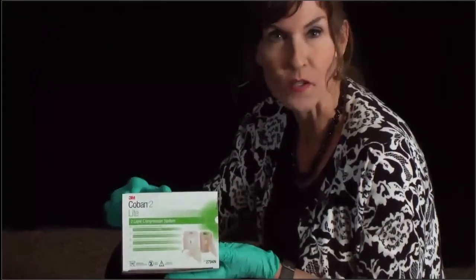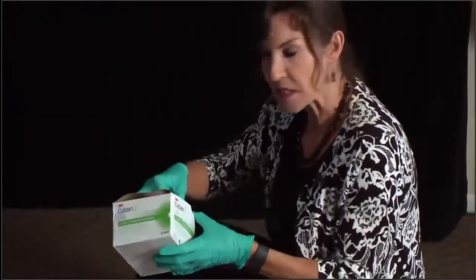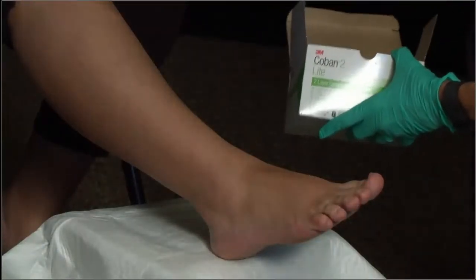There are a variety of different products on the market — this is just one of many. It is no better, no worse than any of the others, but it's a product called Coban 2Lite, which I use quite a bit. Usually with these wraps it involves two to four layers, and today we are going to use a two-layer system.